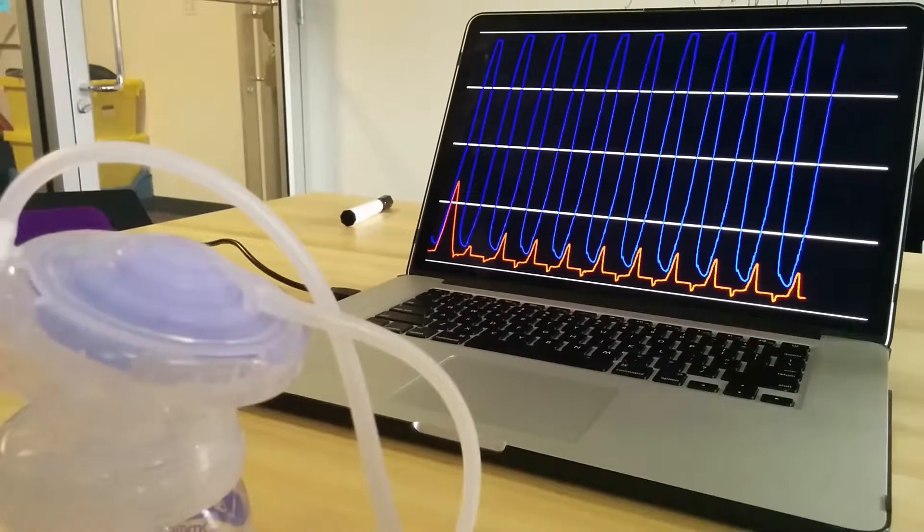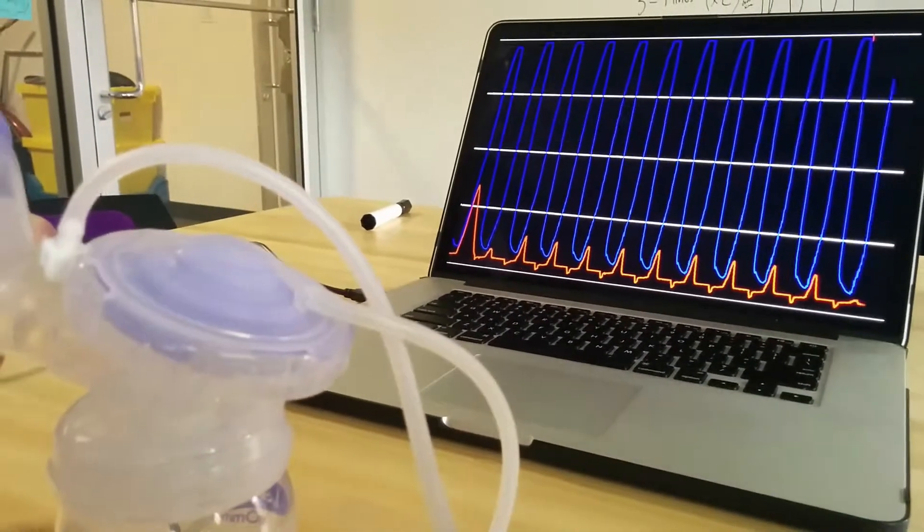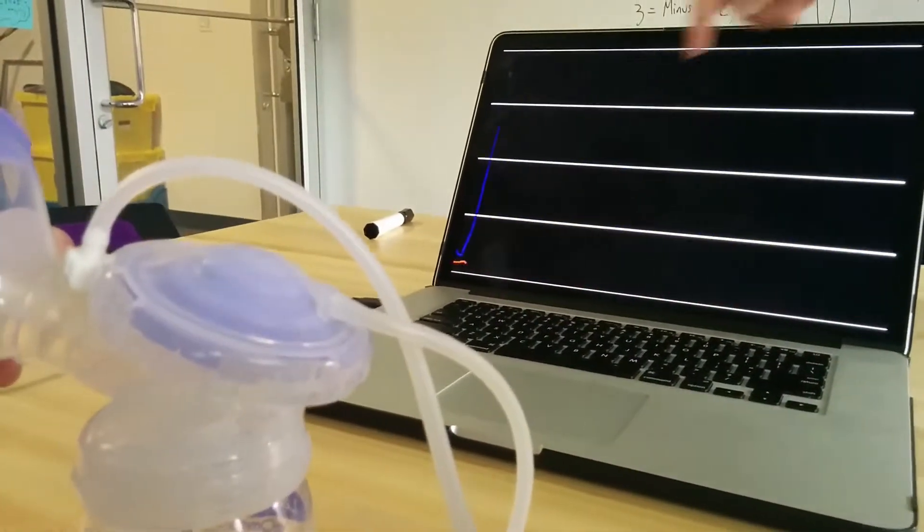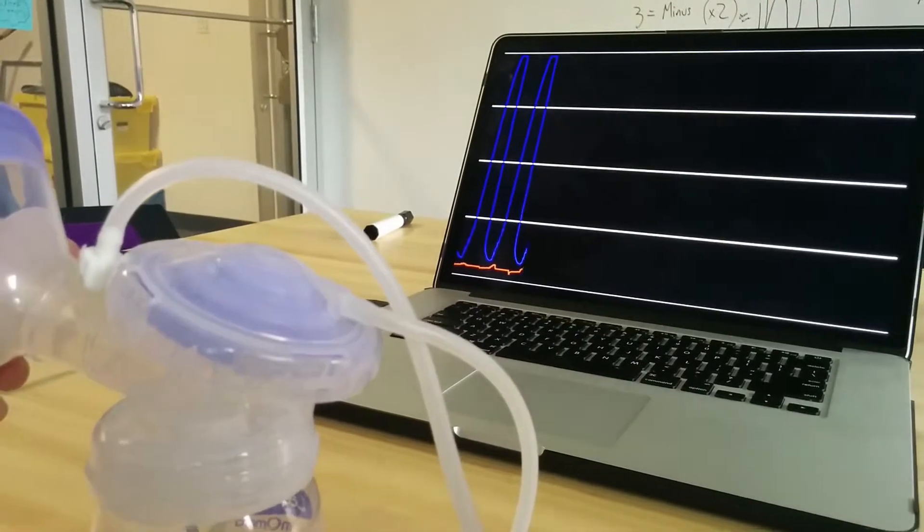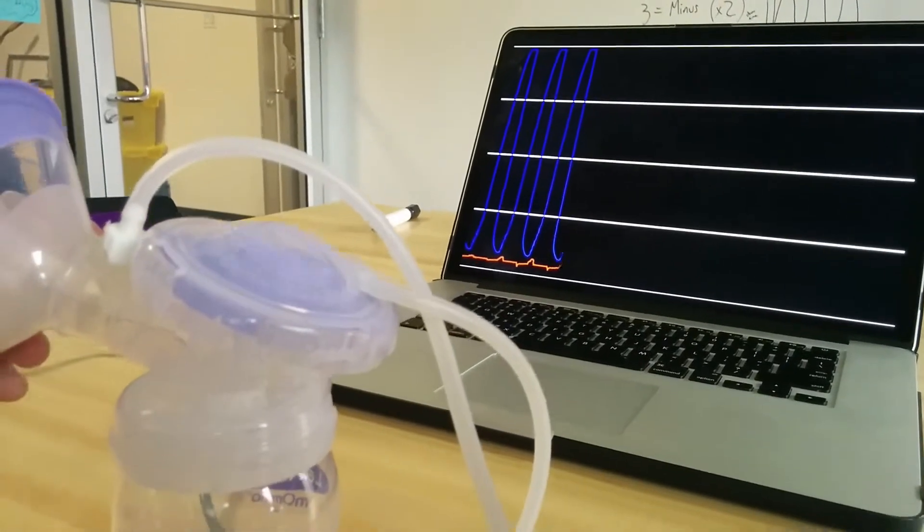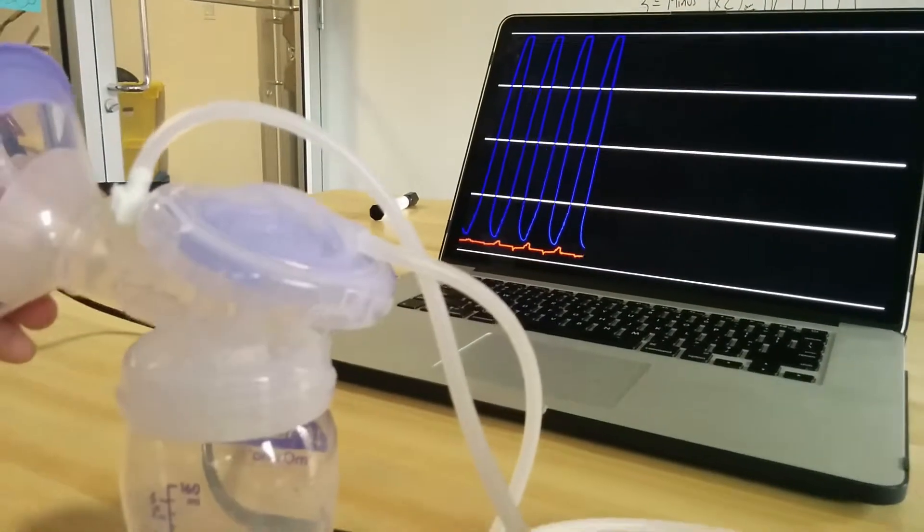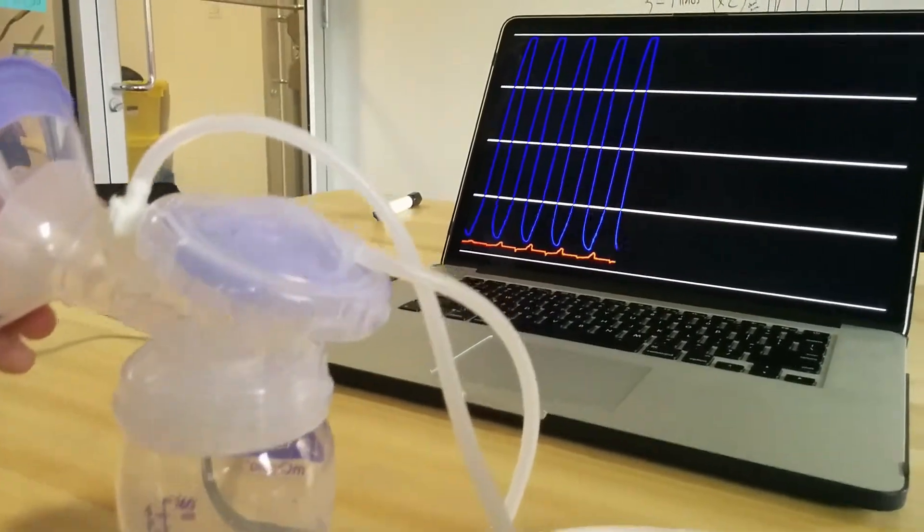If we lose the seal, you can see that we flatline. Now the pump and the software are aware of all three of those states.